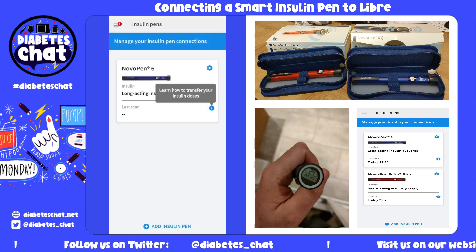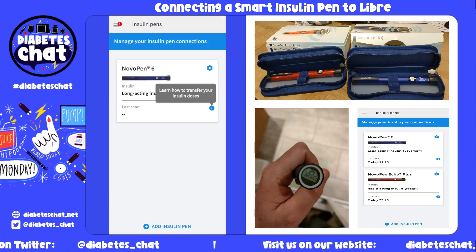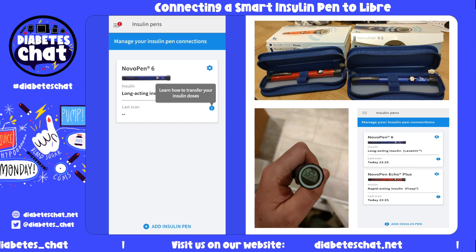So there you go, you can see the pen has been installed. You can also add your other pens as well — your quick-acting pens.